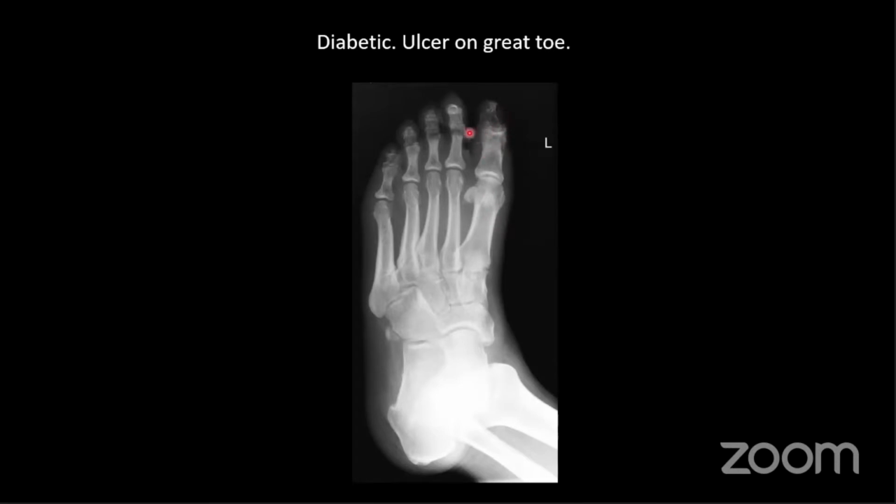You don't want to take off the distal phalanx and find that the rest of the toe is also not viable. So in summary, do a follow-up film, or if you want an immediate answer, we do an MRI.